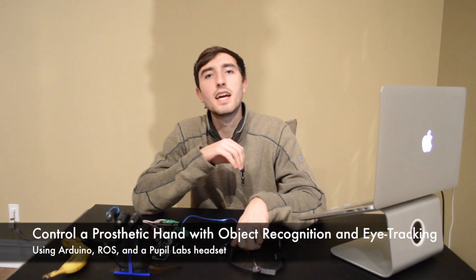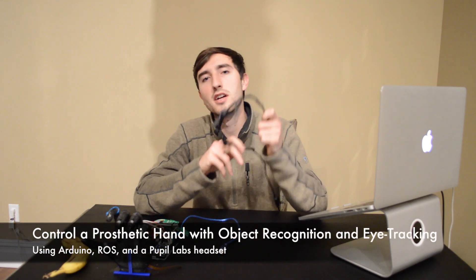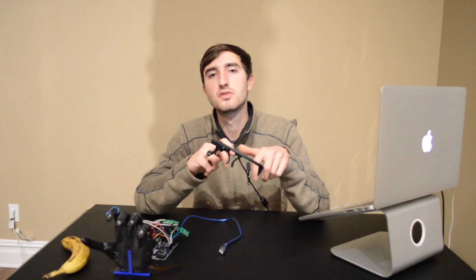Hi, I'm Jesse. Today I want to demonstrate a project that I've been working on that uses real-time object recognition and eye tracking to control a prosthetic hand.